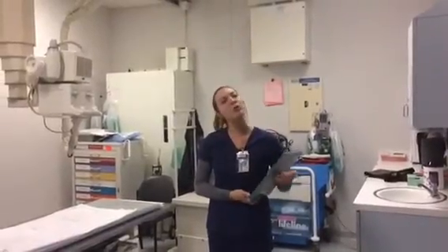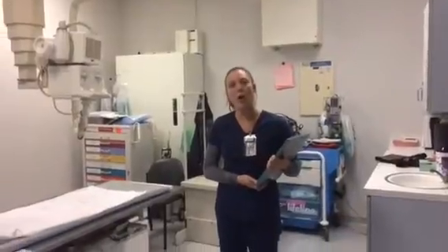My name's Judy, and we're going to be doing some knee x-rays today. So the first three projections that we're going to be doing of the knee are the AP projection, the AP oblique with medial rotation, and the lateral.